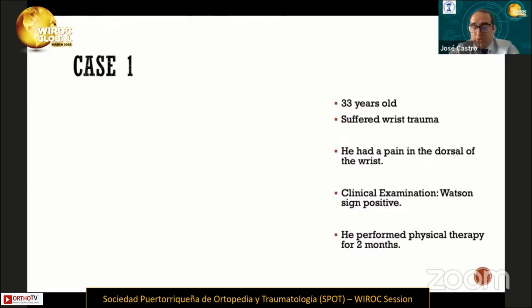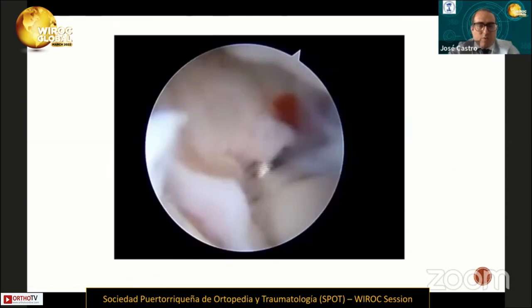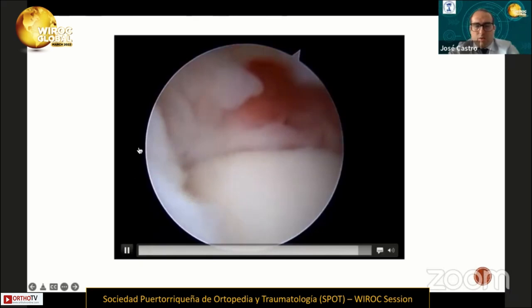This is the MRI of this patient. We can see the partial scapholunate tear, and we proposed this arthroscopic dorsal repair. First, we evaluated the scapholunate ligament, and in this patient, the probe entered between the scapholunate ligament at the dorsal segment. For that reason, we classified this patient as EWAS 3A.